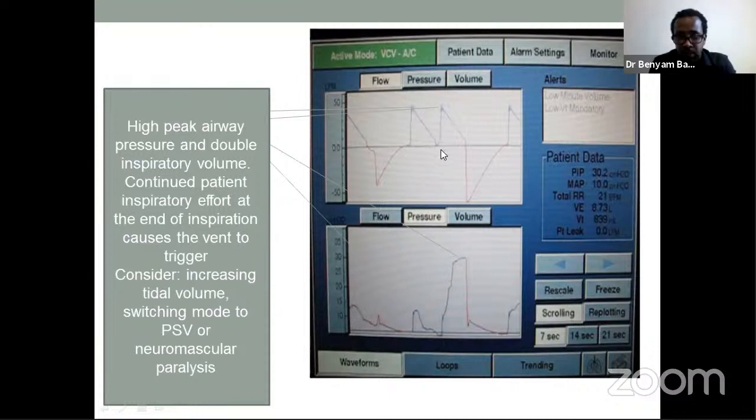There was the inspiratory hold time, but the patient triggered a certain pressure here, or the negative pressure here. This causes a certain pressure to be given or tidal volume to be delivered. So the pressure rose. As you can see here, the patient had 2 inspirations consecutively without expiration.